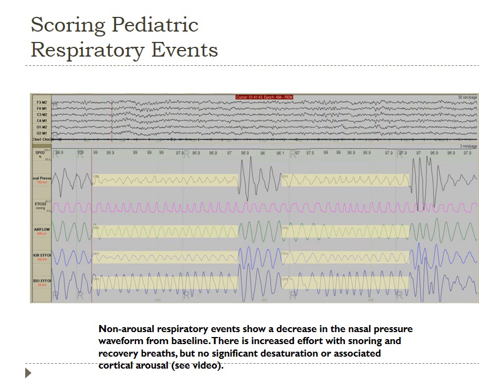Here is a pediatric polysomnogram showing a non-arousal respiratory event. You can see the SpO2, nasal pressure transducer, end-tidal CO2, airflow, thoracic effort, and abdominal effort channels. In all respiratory monitoring channels, there is a significant decrease for more than two breath cycles. However, there is no arousal and the end-tidal CO2 does not rise significantly, making this a non-scorable event.